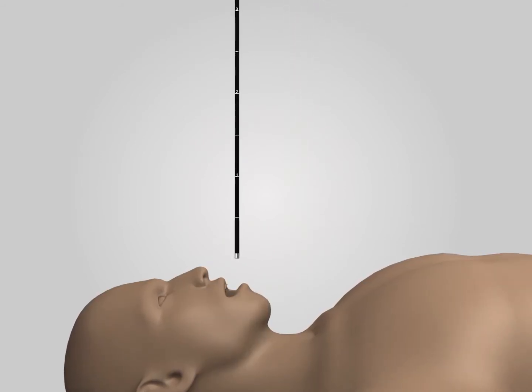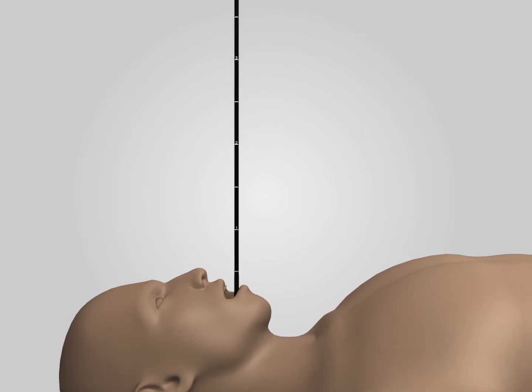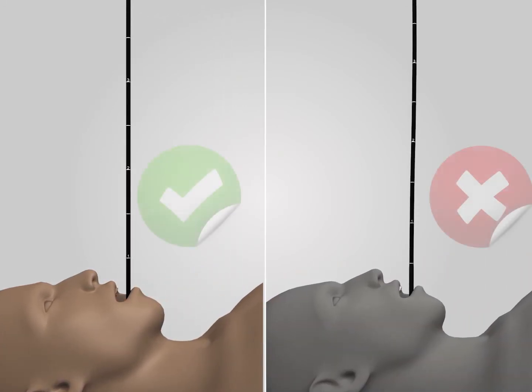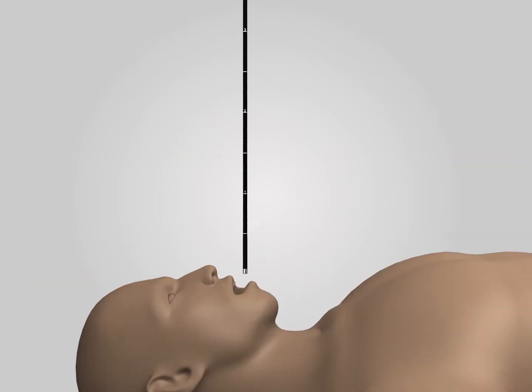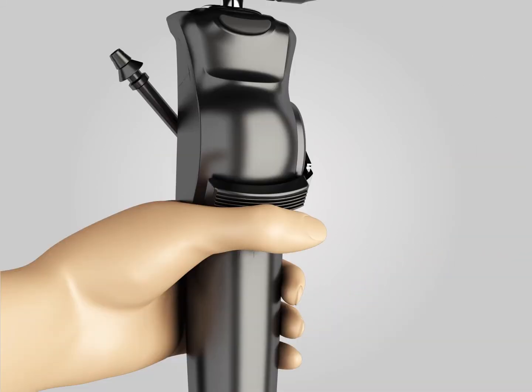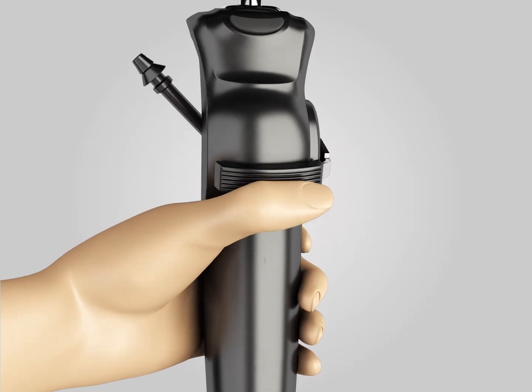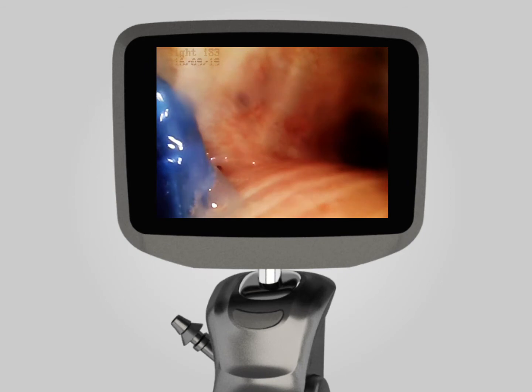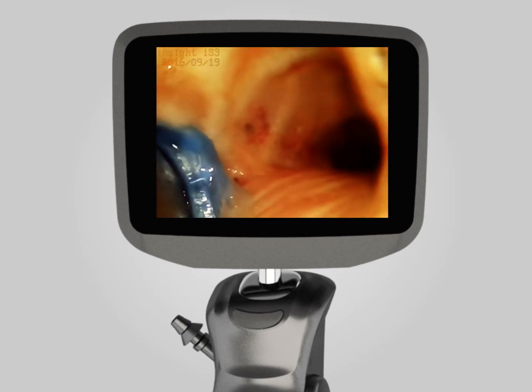The IS3CF Video Flexible Laryngoscope has similar operating skills to traditional bronchoscopy. Avoid twisting the insert tube during operation, and keep movements gentle while adjusting angle and inserting. When withdrawing, adjust the angle to vertical and release your thumb from the lever. Necessary training is required to become proficient in operation.